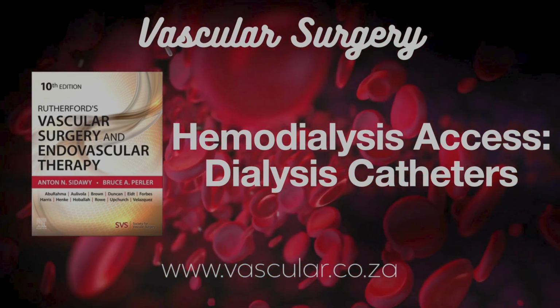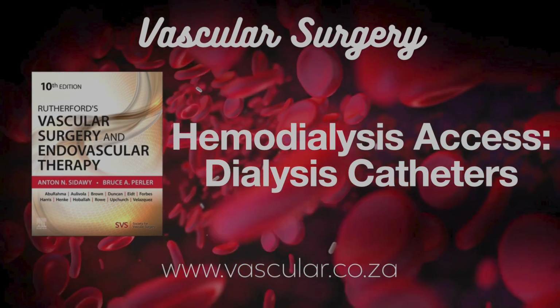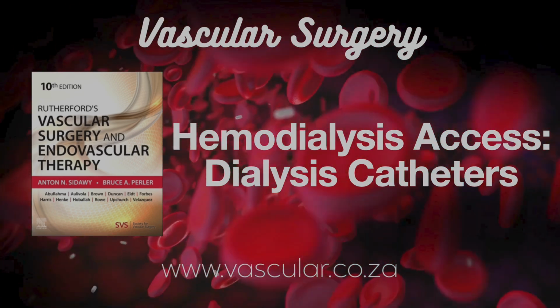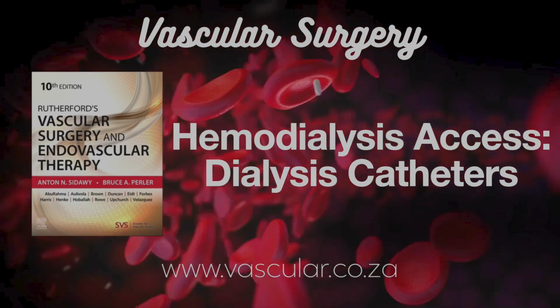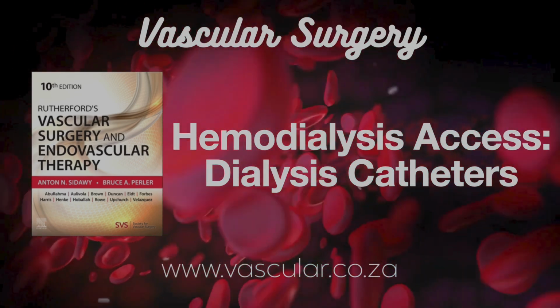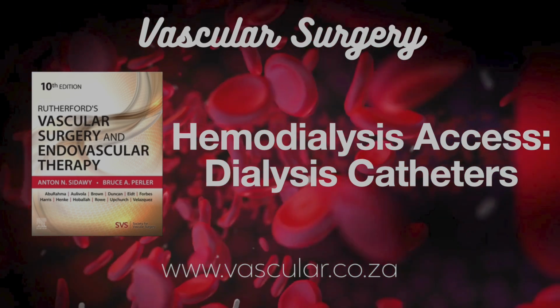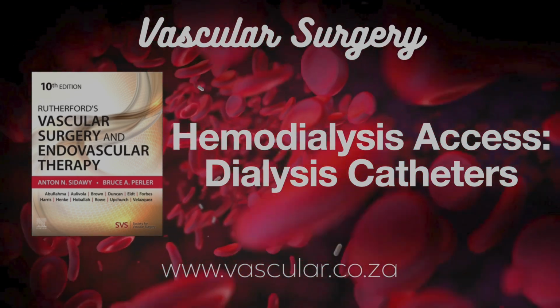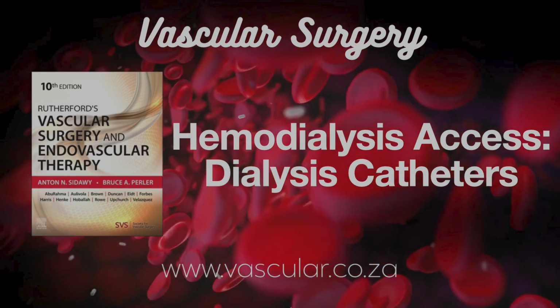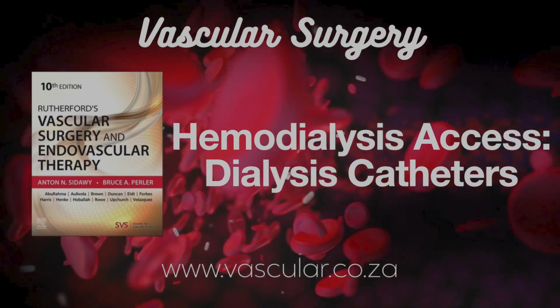And definitely better than the femoral vein in the leg. Oh yeah, femoral catheters tend to have the shortest lifespan. And we really try to avoid the subclavian vein under the collarbone. Why avoid the subclavian? Because putting a catheter there has a higher risk of causing stenosis or narrowing of that vein down the line, and that can totally mess up your chances of placing a good permanent fistula or graft in that arm later. It's all about preserving future access options.